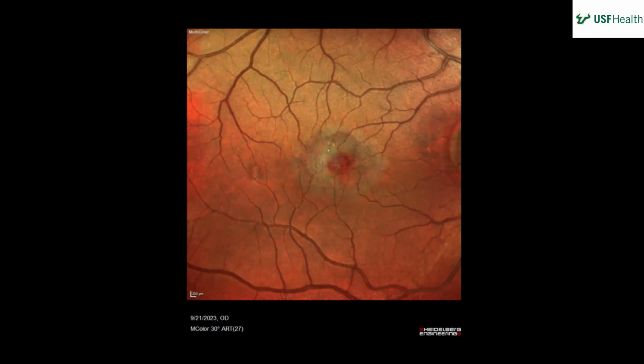Okay. So just pretend it's a color picture and tell me what you're seeing. Maybe some speckled spots around the fovea, but it looks to be largely normal to me. Well, compared to normal, it's kind of a ring. It's like a donut in the middle. Oh, okay. So normal multicolors don't have that ring. So it's a ring surrounding the foveal area? Yeah, center of the macula. Okay.